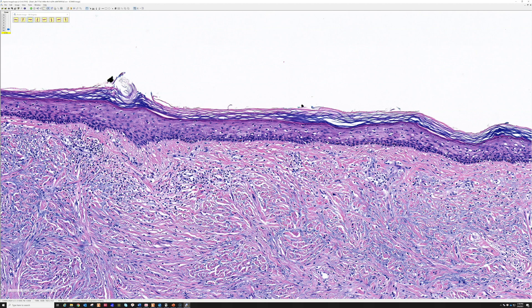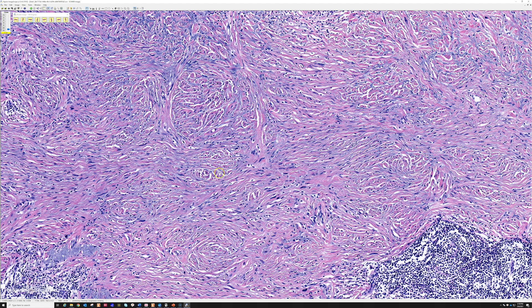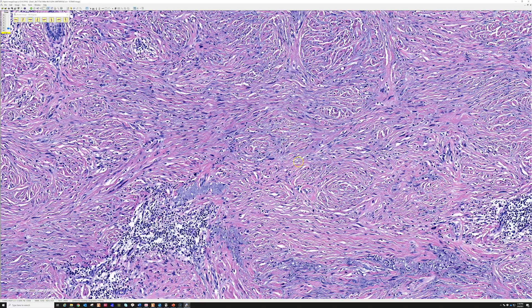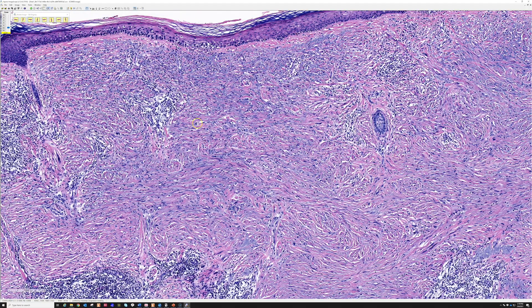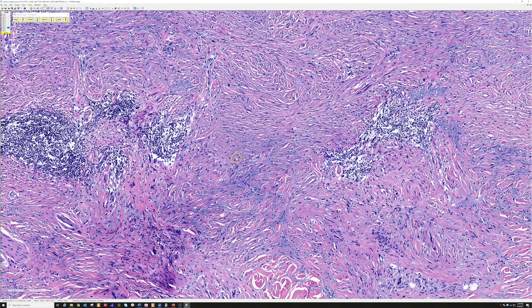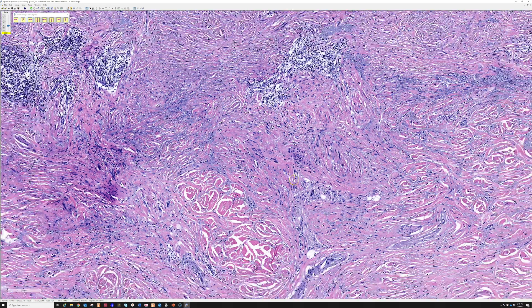When 90% or more of the lesion is hypocellular with a background of collagen like this, we call it pure desmoplastic melanoma. These tumors behave differently on a depth-for-depth basis and tend to have a better prognosis than other forms of melanoma. Sometimes there are areas combined with more obvious nested epithelioid or cellular spindle cell melanoma - those are called combined desmoplastic and conventional epithelioid melanoma, and they behave more like typical melanoma.